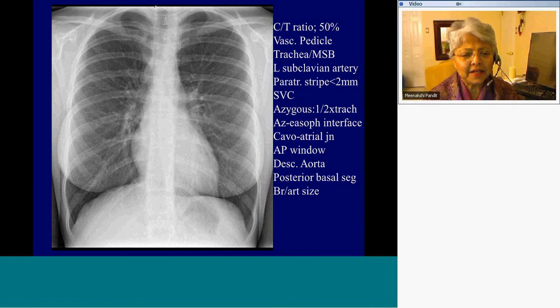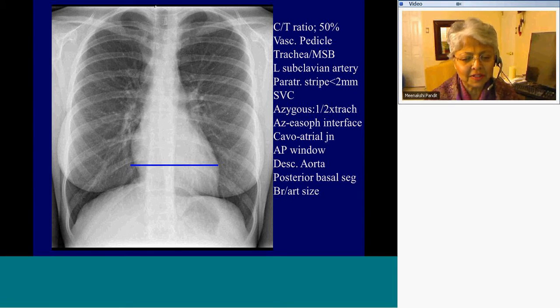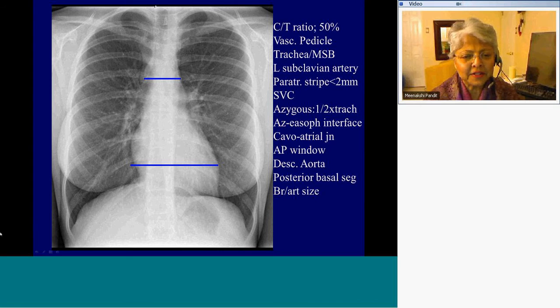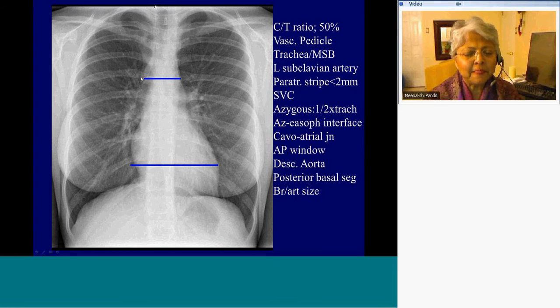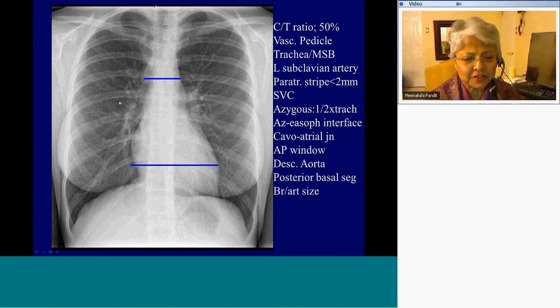This is a normal PA radiograph. The cardiothoracic ratio is 50% — the coronal diameter of the heart should be half that of the coronal diameter of the chest. The other diameter to remember is the vascular pedicle, which is the composite of venous and arterial structures emanating from the heart, and it gives us an idea about the fluid status of the patient.